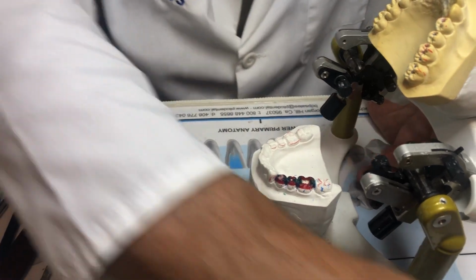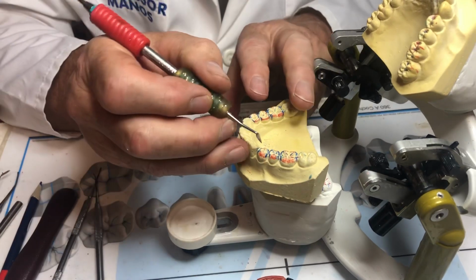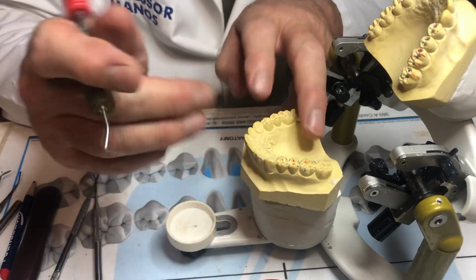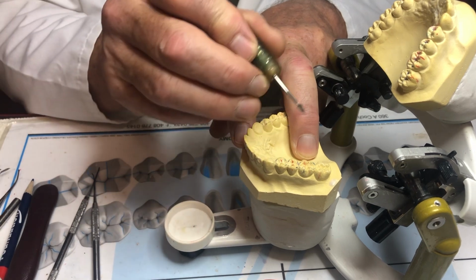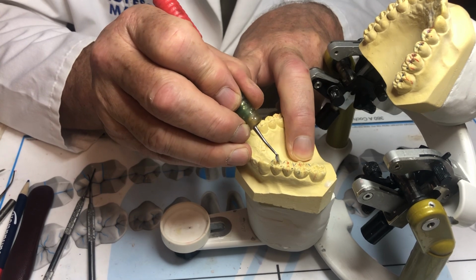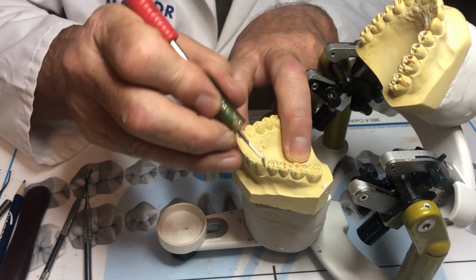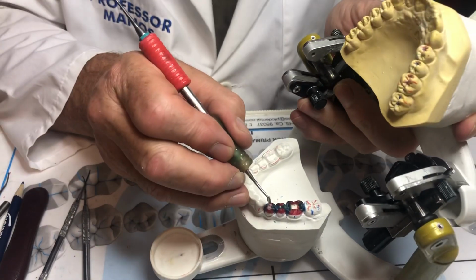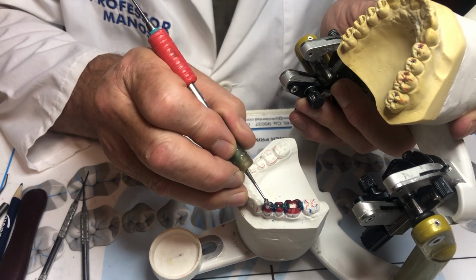Again, if you're not sure how to touch it up, go back to the master model. Hold the model in your hand, take your instrument, and just follow through these grooves. So if you're getting used to the movement, everything's curved, there's nothing straight in anatomy. If you want to carve a triangular fossa, make believe you're carving it. Get the hang of going like this on the model, and once you can do that, then translate it, come down here, and actually do it. So there's my triangular ridge.